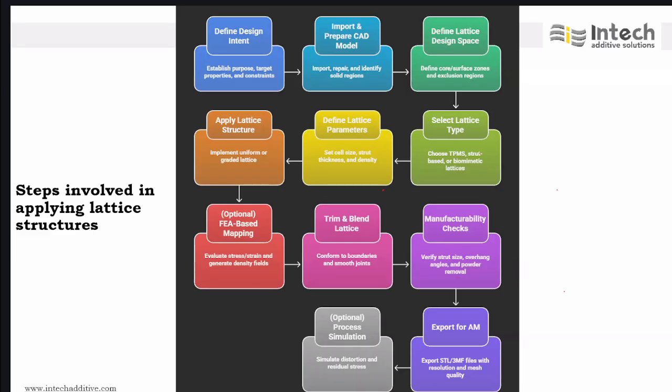You also need to identify the solid regions. Then if there are any overlaps, any holes or gaps, you need to clean them up before latticing. And then the third step is about defining the lattice design space.